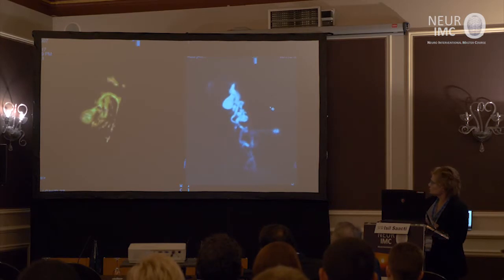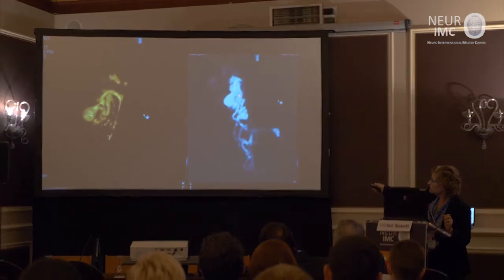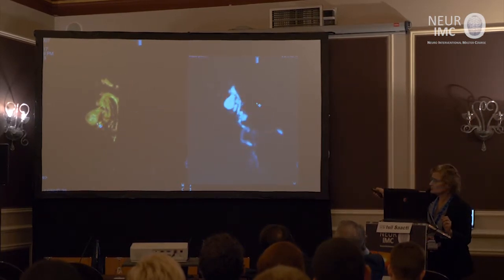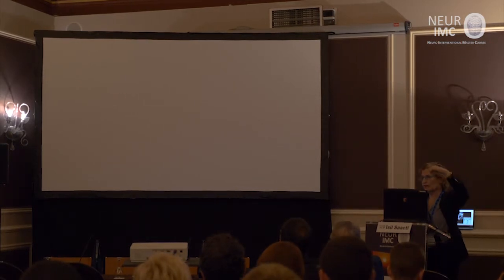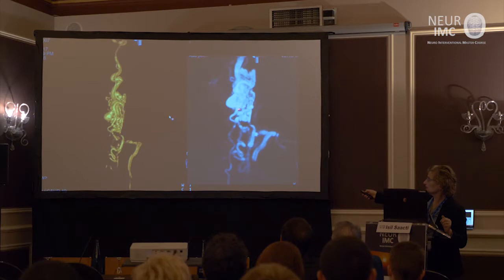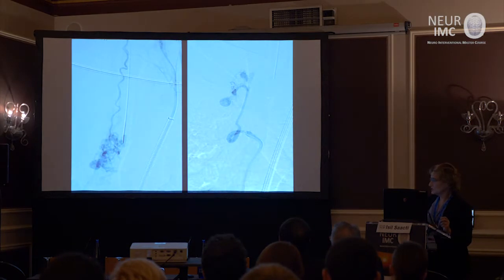So it was very helpful for us, especially in those MIPs. We realized this is the sulcal artery, only this amount, and then comes the big aneurysm. However, when you rotate it, we realize that from the aneurysm, the feeder is continuing and recruiting the vascular malformation. So we thought if we can go all the way distal to that aneurysm, we can embolize the AVM as well as eliminate this aneurysm, at least decreasing the risk to the patient, although it may not provide a cure.